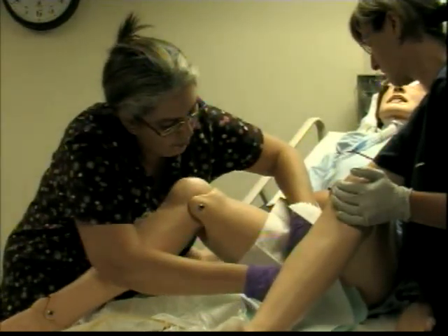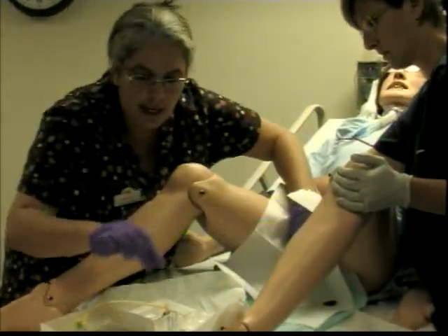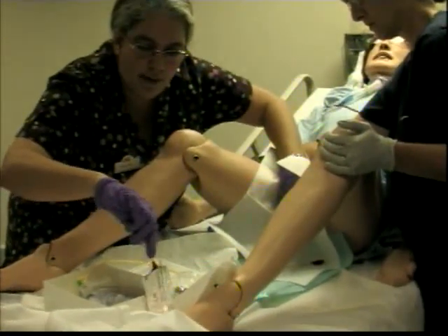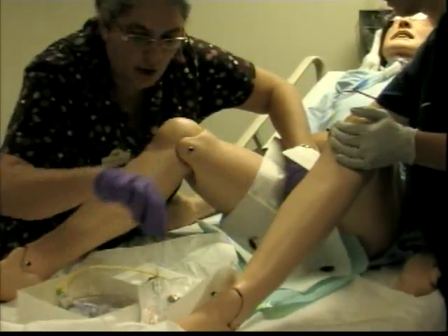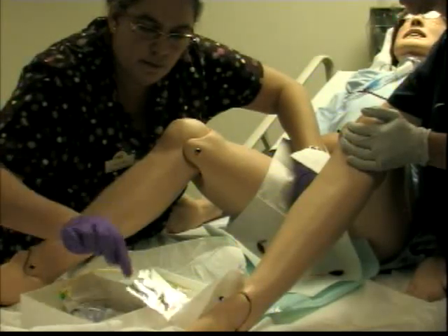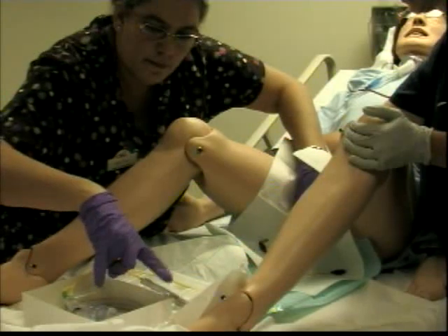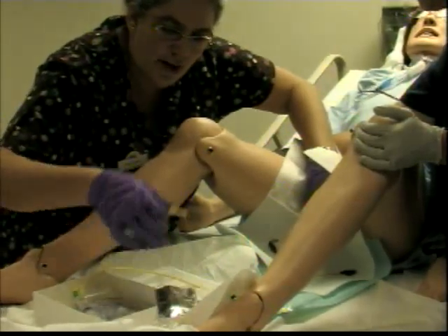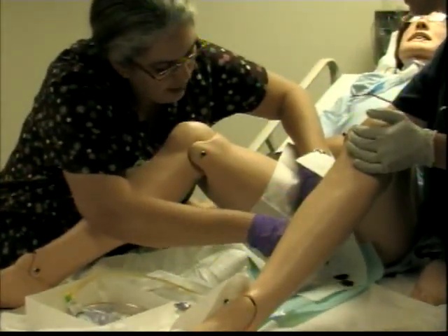You're going to swab from front to back — one sweep motion from top to bottom towards the back. First swab: start away from you, then discard. Second swab: close to you, pull and discard. Third swab: down the middle and discard. That's the cleaning technique.